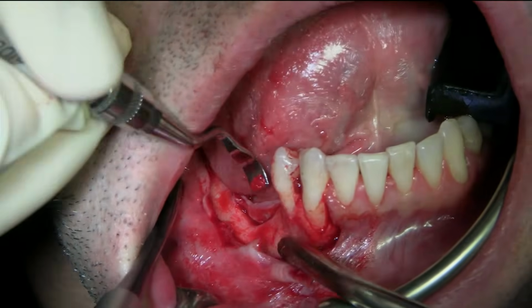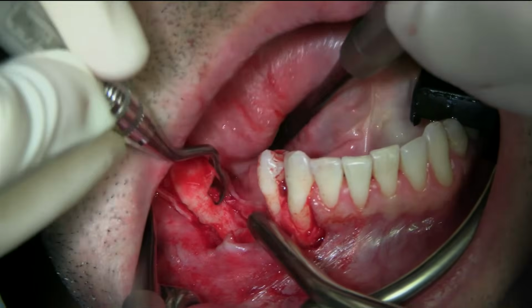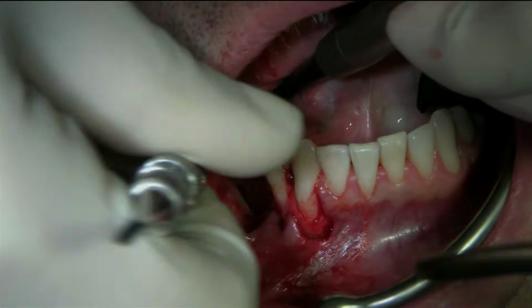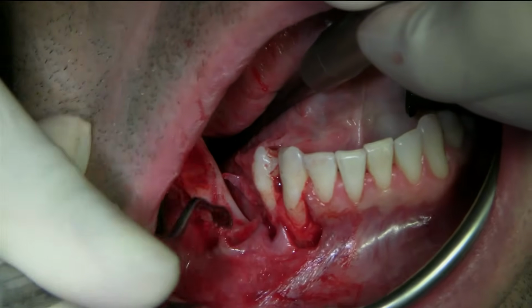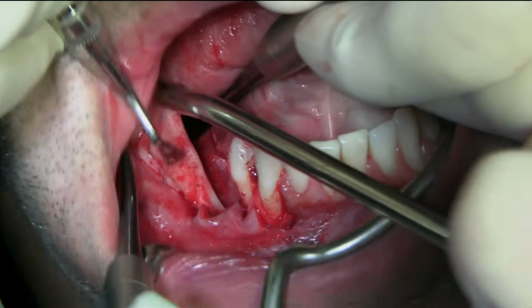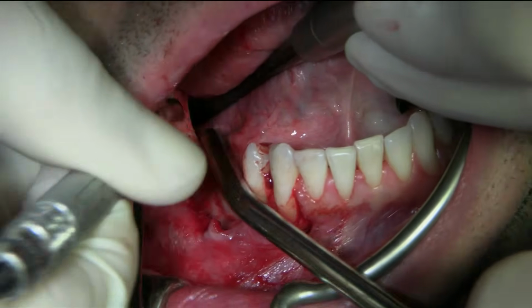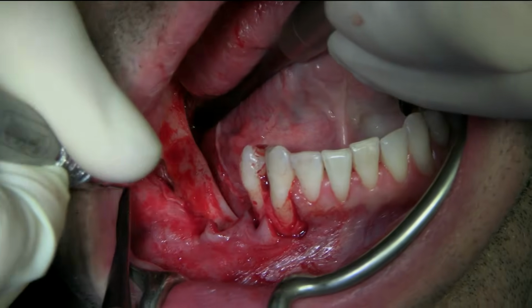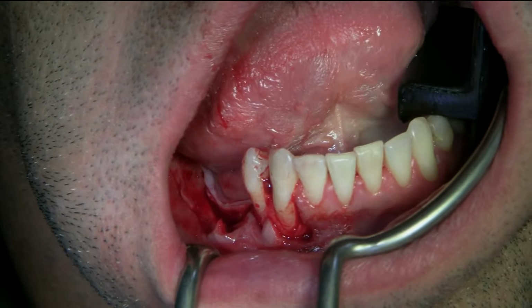This is now just to prepare the ridge. That's all clean. Okay, I got that. Let's go.